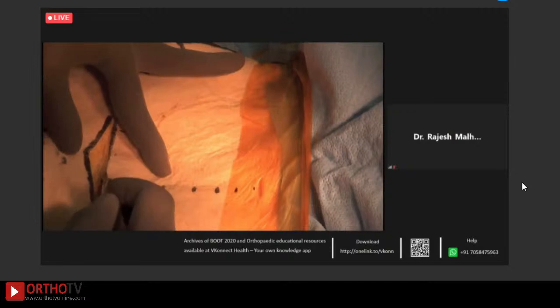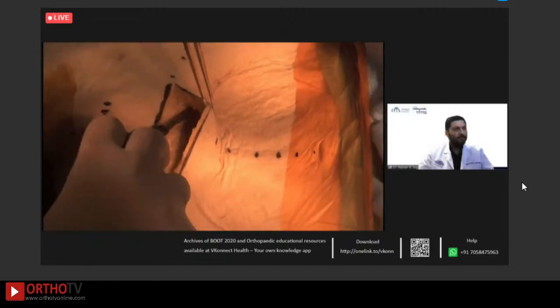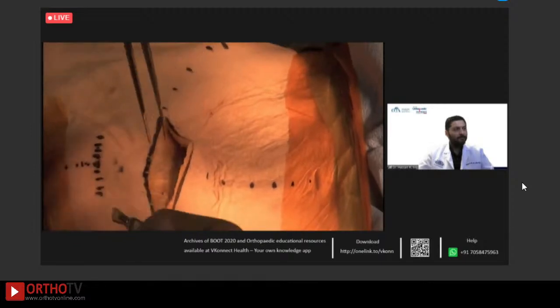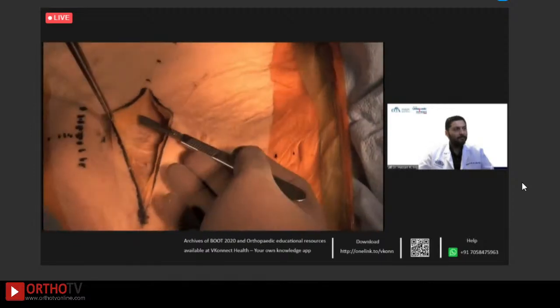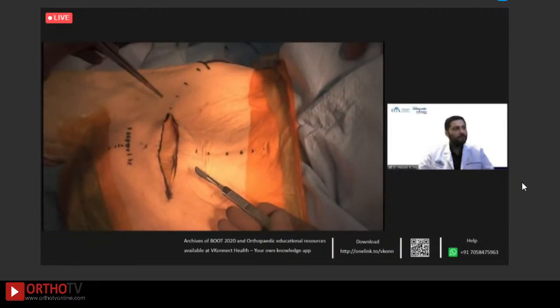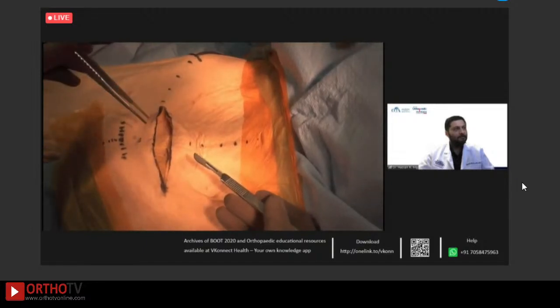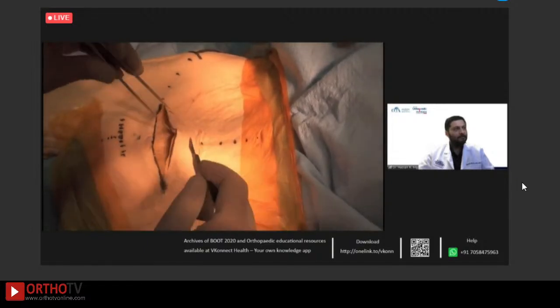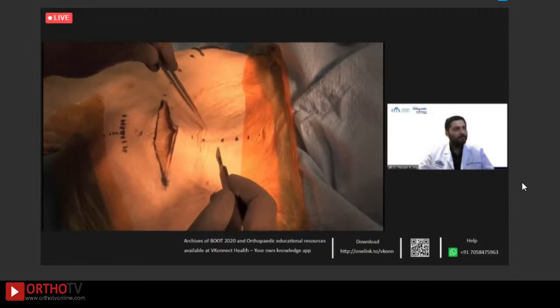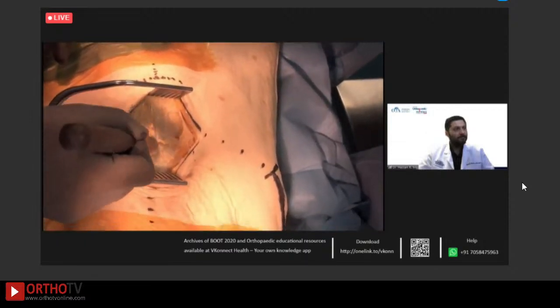After incising the skin, the subcutaneous tissues are elevated. This dissection is performed in live surgery with wood-handled elevators and electrocautery to maintain hemostasis. Subcutaneous flaps are developed proximally and distally to aid in exposure and mobility of the surgical window. It's most important to develop this in the cephalad and caudal directions, as these will aid in deep visualization. Lateral dissection places the spermatic cord at risk.